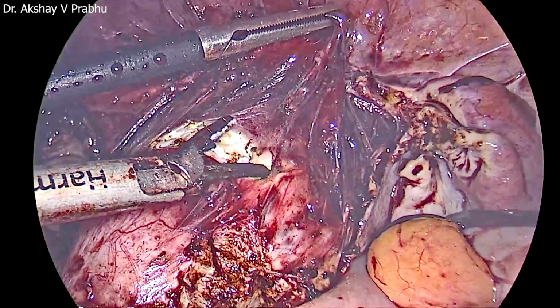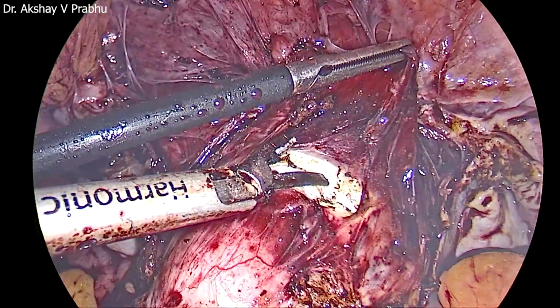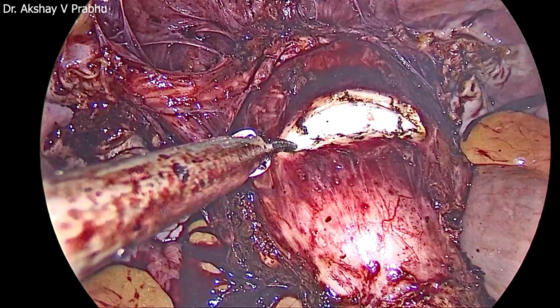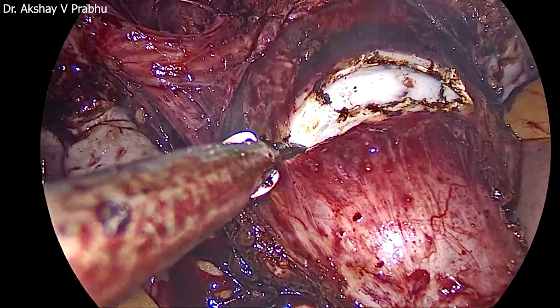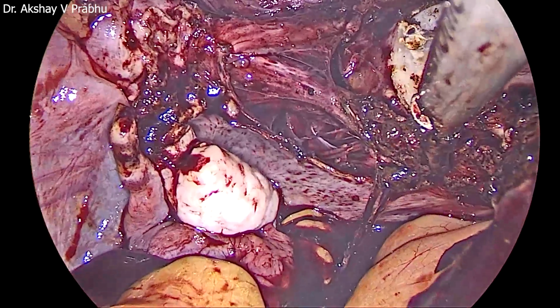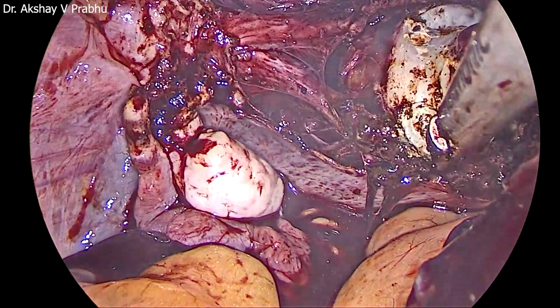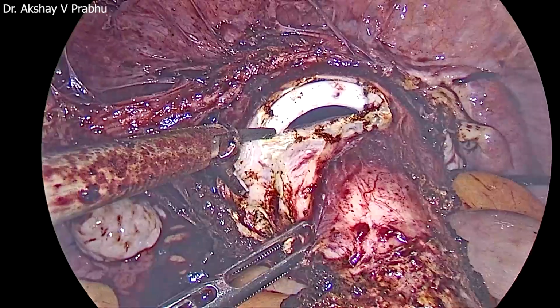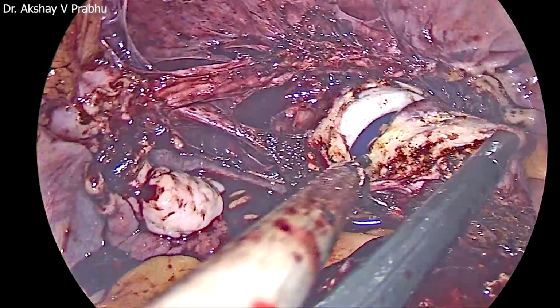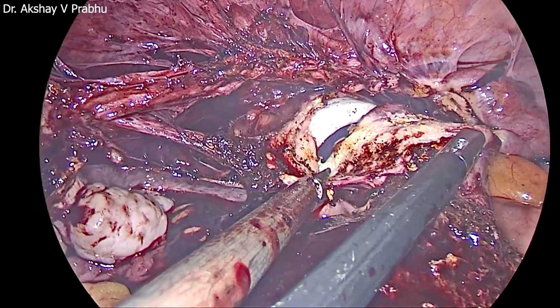Point to be noted is that just use one blade, the active blade of the harmonic scalpel. More than cutting, it's drawing. It's actually a drawing on the bulge which is due to the vaginal tube. So once the bulge is seen and you have cut and you have exposed the cervix, you can actually pull back the tube and just follow the borders of the cervix, putting the uterus on stretch.